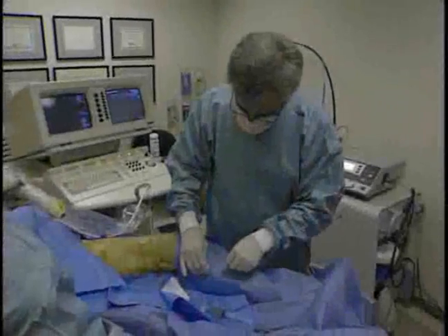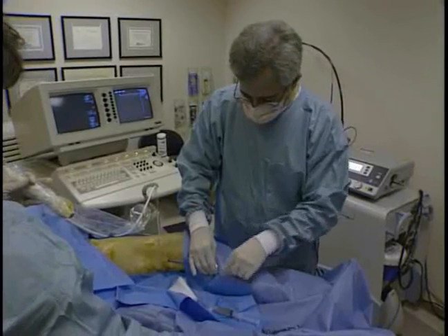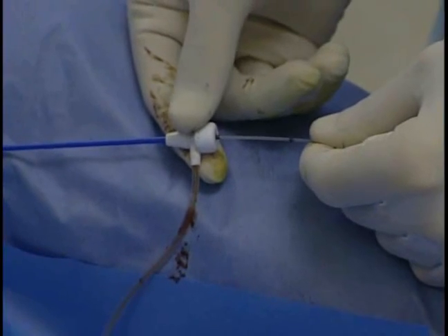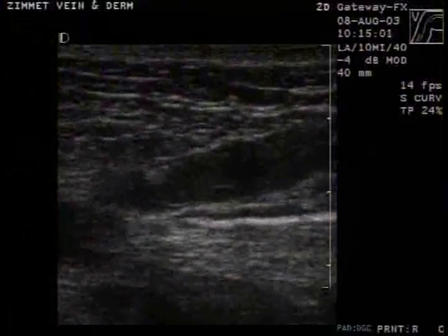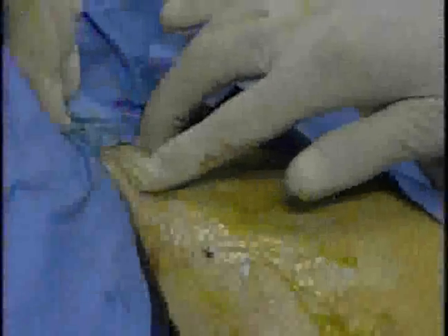A 600 micron Diomed laser fiber is inserted into the sheath and advanced up to the first site mark, indicating that the distal tip of the laser fiber is flush with the end of the sheath. The sheath is then withdrawn to the second site mark, exposing the distal 3 centimeters of the bare-tipped laser fiber. Verify that the laser fiber tip is about 1 centimeter distal to the SFJ with ultrasound and by checking the location of the aiming beam.